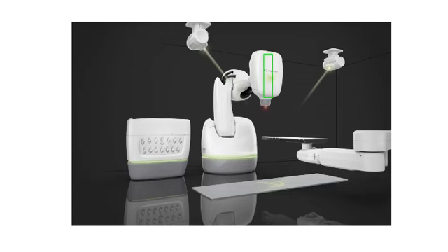The main component of this is a linear accelerator in the X band, and you see the beam come down here. It's very compact, so it can be put on this manipulator arm that can move it around in 6 degrees of freedom and point in different directions. So it's a non-isocentric system.